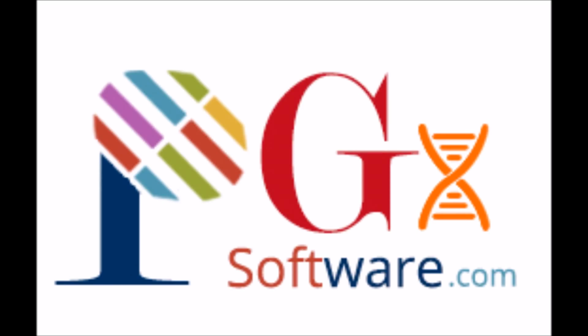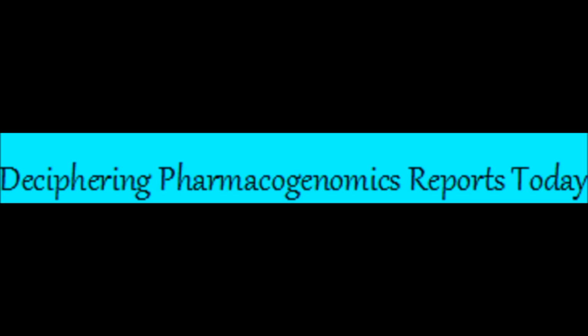How does the PGx software program work? PGx software meets the needs of labs that want to offer clients cutting-edge pharmacogenomic interpretation without personally bearing the cost of the necessary tools and personnel to do so.